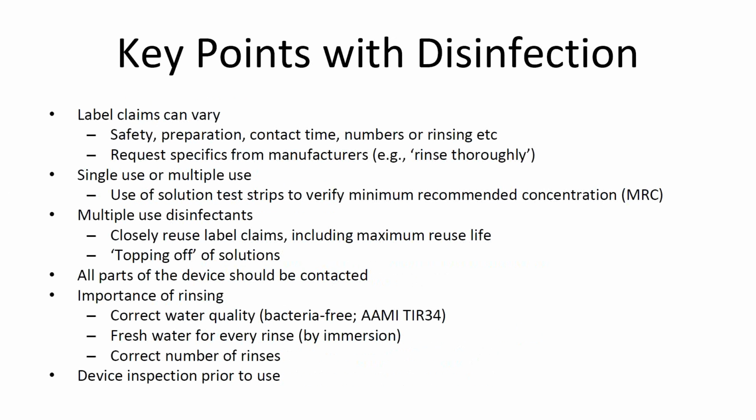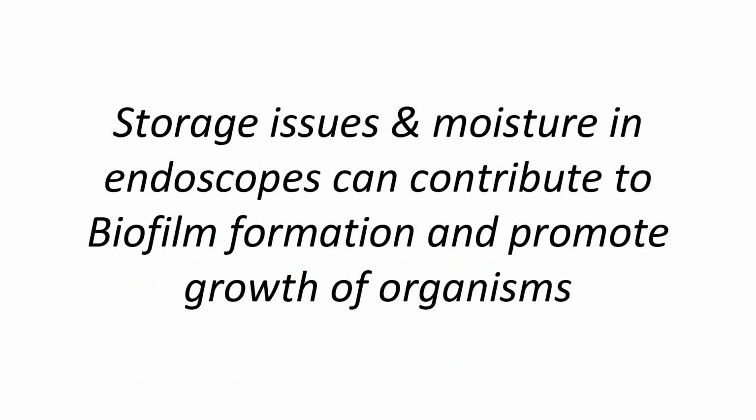So we're looking along the way of reprocessing to make sure that we don't see residual debris and that we don't see damage to the endoscope. Next slide, please. We're moving on now to storage and moisture in endoscopes.